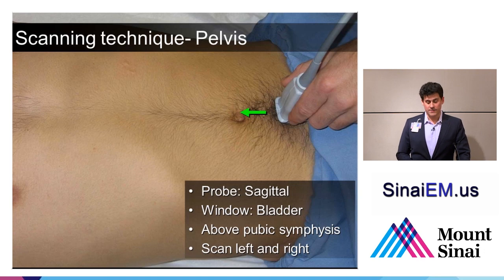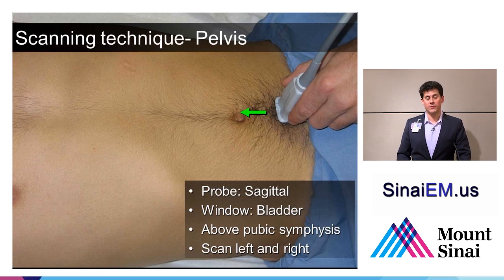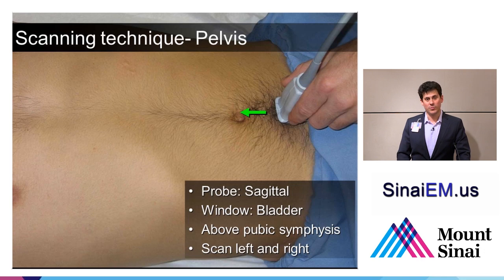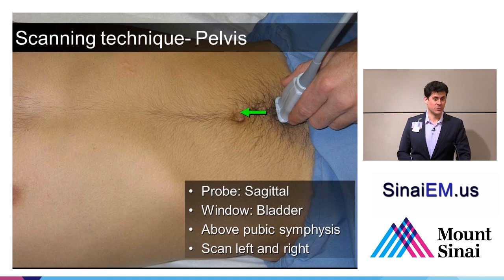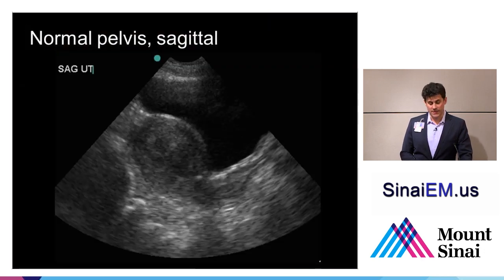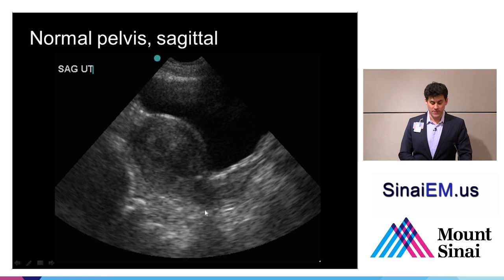For the sagittal view, we're going to ideally use the bladder as a window and aim just above the pubic symphysis. A lot of people go up too high towards the umbilicus, which really limits the view, especially when the bladder isn't very full. Putting the probe right on top of the pubic symphysis and angling down should help you image the pelvic cul-de-sac even when the bladder is relatively empty. Then we fan the probe towards the left and towards the right, looking for fluid in the dependent areas behind the uterus and behind the prostate. In this female pelvis, we see a very large bladder creating a nice acoustic window for the uterus, and behind the uterus is where we look for fluid — in this case, there is none.